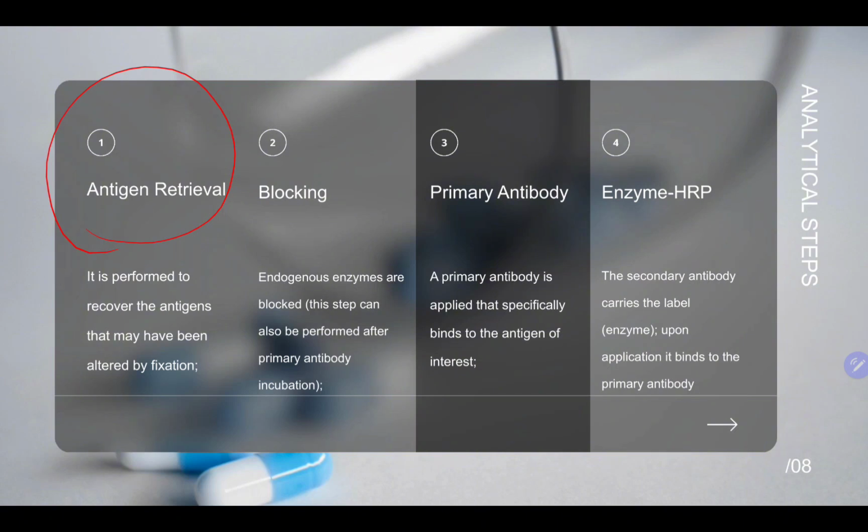So remember po, ang specimen na receive natin sa IHC, blocks and slides na lang po. Blocks and slides that are nanggaling sa biopsy niyo. Di ba sa biopsy ang gina-receive is yung specimen, histopath request, doctor's request. Sa IHC ang gina-receive natin is the histopath result ng biopsy niya, yung blocks na nanggaling sa biopsy niya, and then yung slides na galing sa biopsy niya. So, ang gina-receive natin for IHC are the blocks and slides.